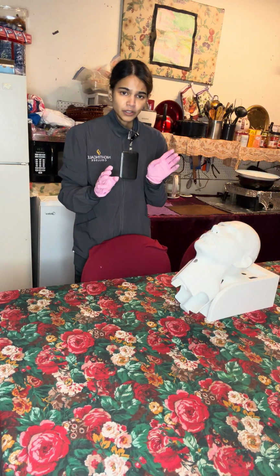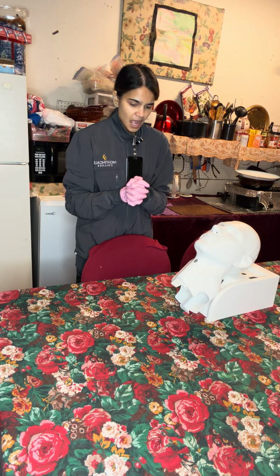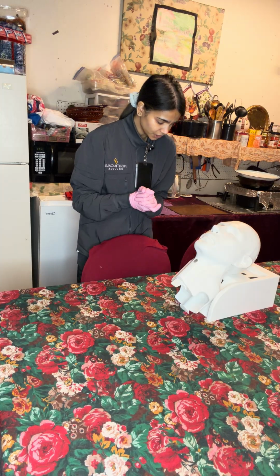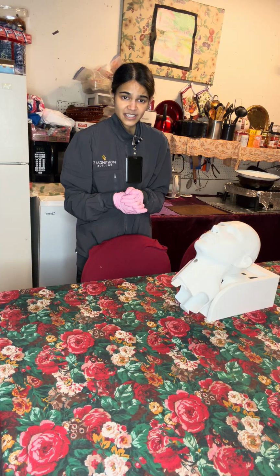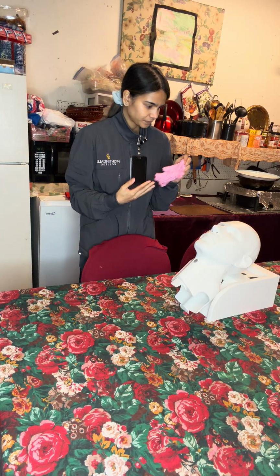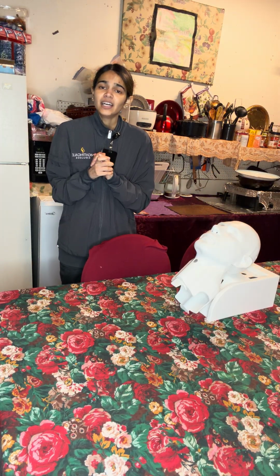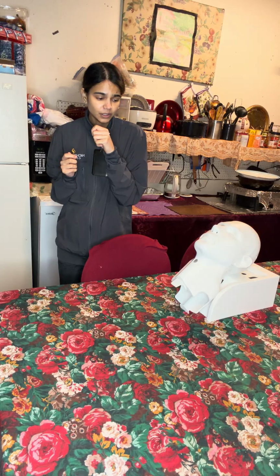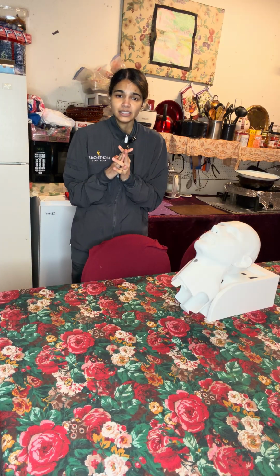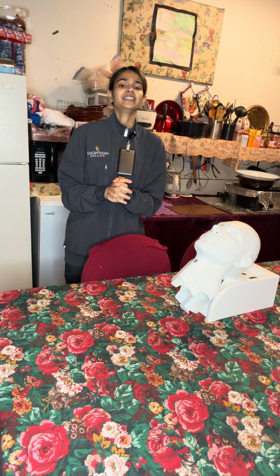Now I will lower the bed to the lowest level and have the call light in reach and ask the patient if they have any questions or concerns. Once that has been completed, I will remove my gloves, dispose of them, perform hand hygiene, ensure patient privacy by closing the curtains and exit the room. Then I will document the procedure that was performed and any findings that I have found. Thank you so much.